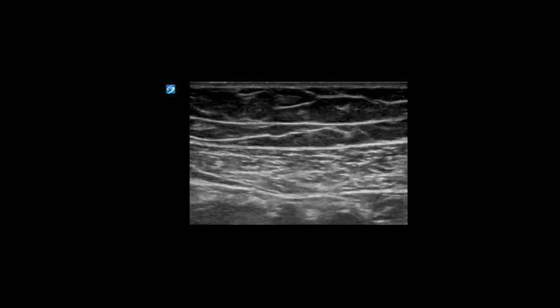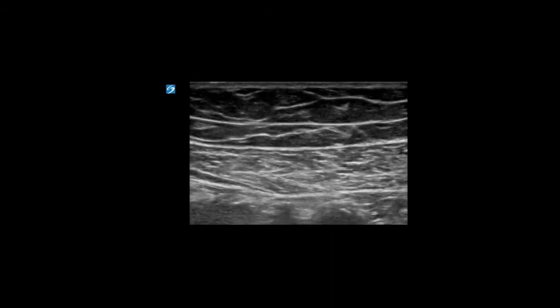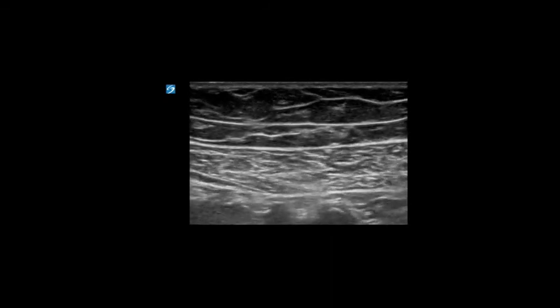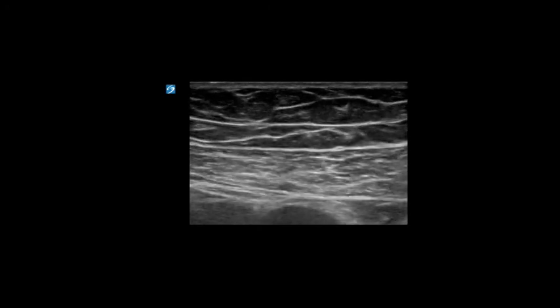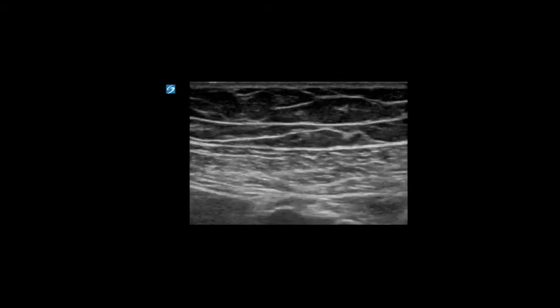But imagine you ultrasound and see this. There's actually nothing abnormal. This is a normal soft tissue ultrasound. So in this case, since we don't see anything, we can't definitively rule out a foreign body with ultrasound, so we might have to do something else diagnostically.